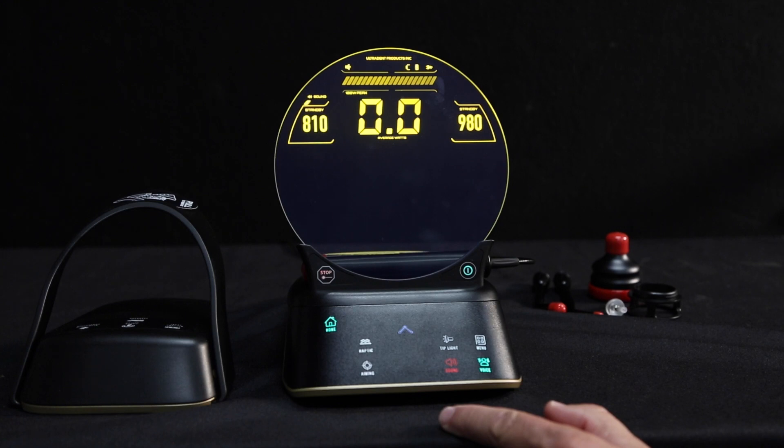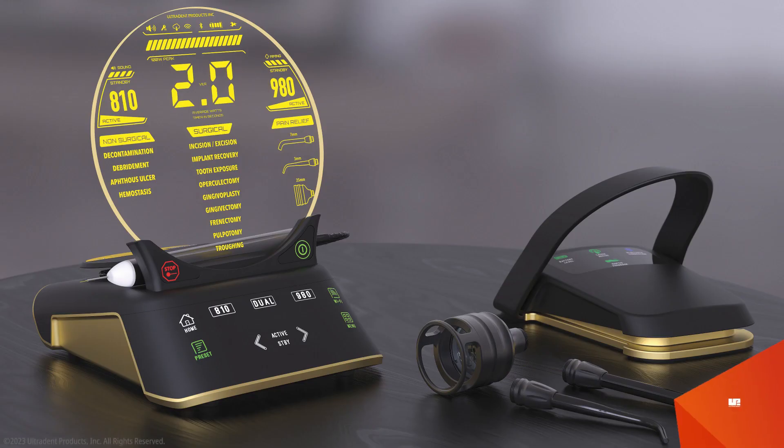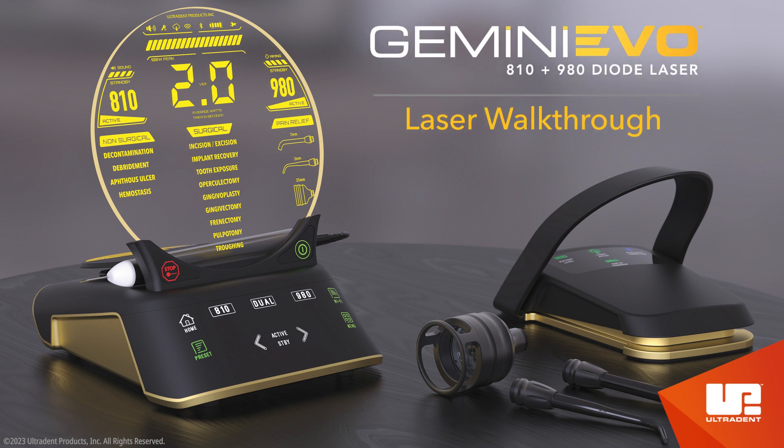Many of the options and settings of your Gemini Evo are customizable through the unit or the dashboard. This concludes the Gemini Laser Walkthrough. Be sure to watch our other Gemini Evo videos — unboxing and dashboard tour — for more information.